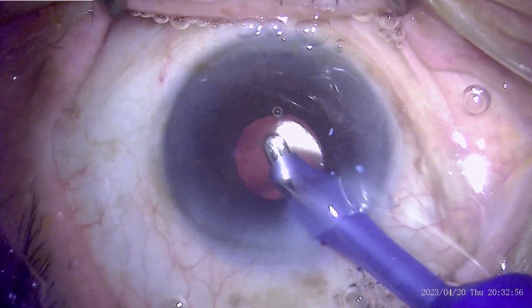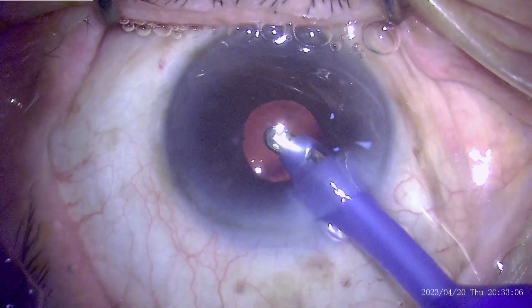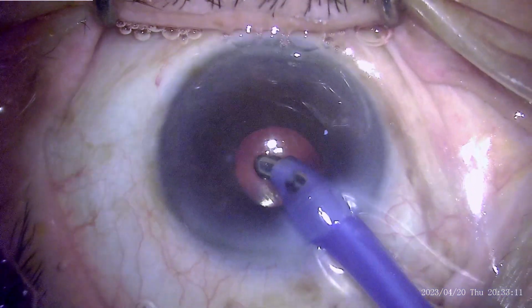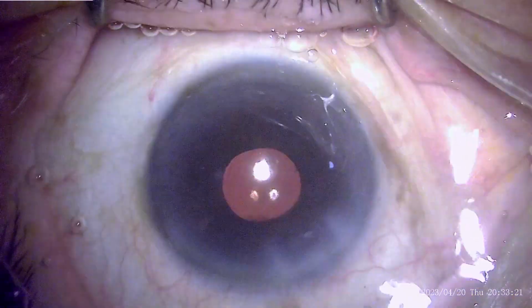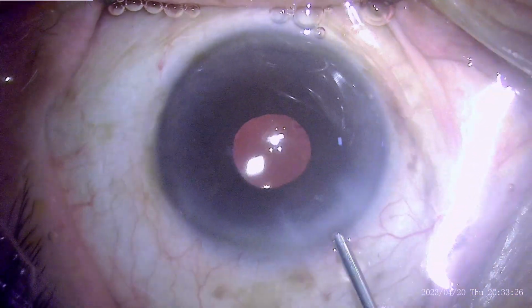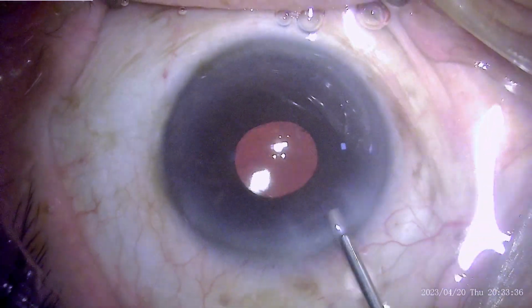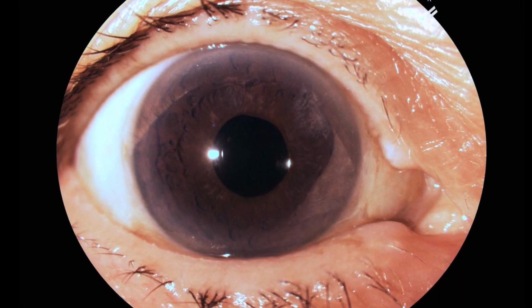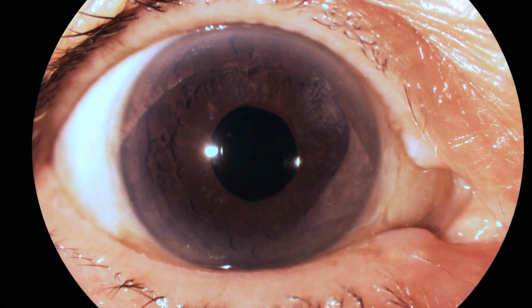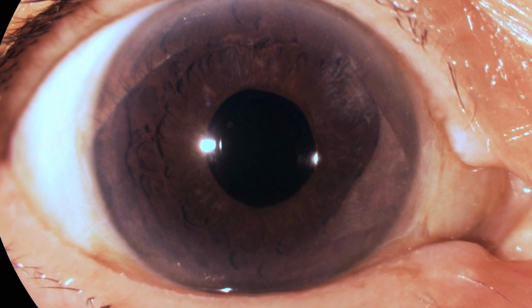Now the surgery is nearly finished and this portion is being run at 2.5 times the speed to remove the viscoelastic gel. And here we have successfully completed this case in which the pupil was extraordinarily miotic, without use of any mydriatic device. This is the day 1 picture, and we can appreciate the patient is doing fine, and at this moment the patient's vision was 6/12 best corrected.